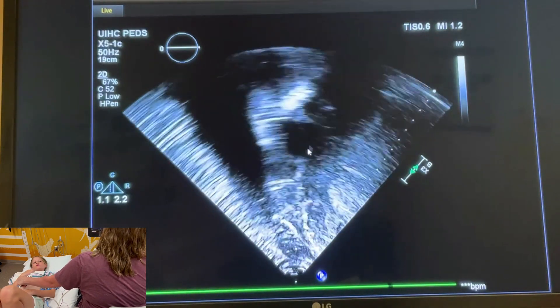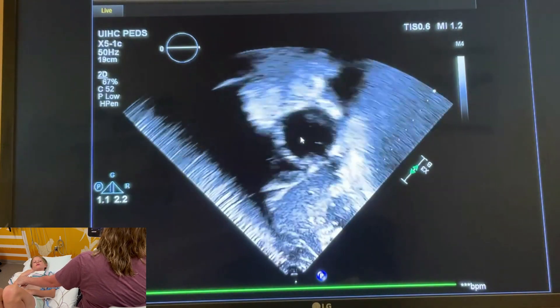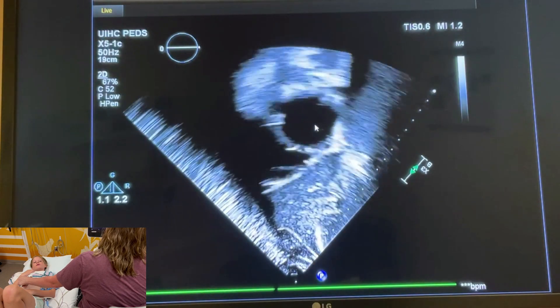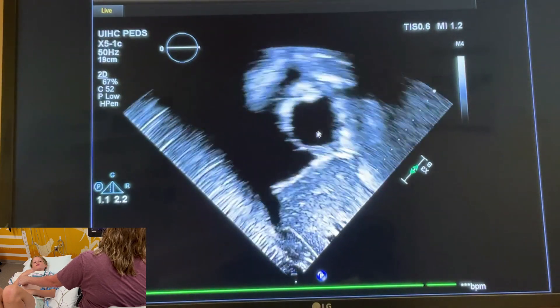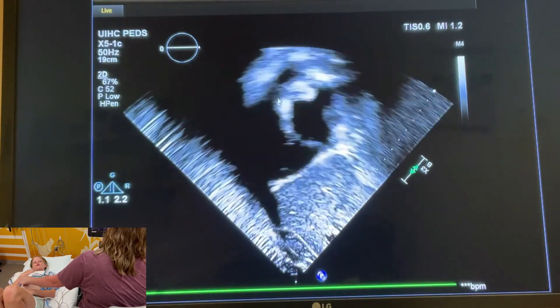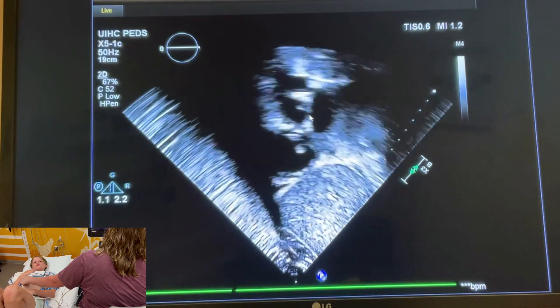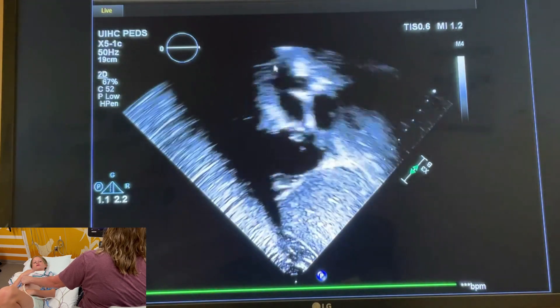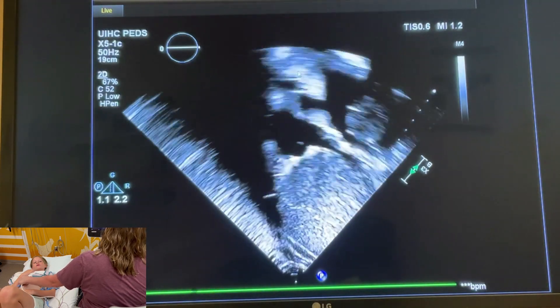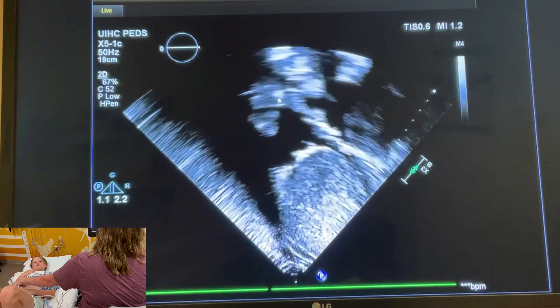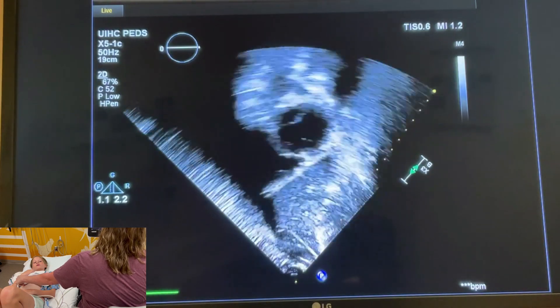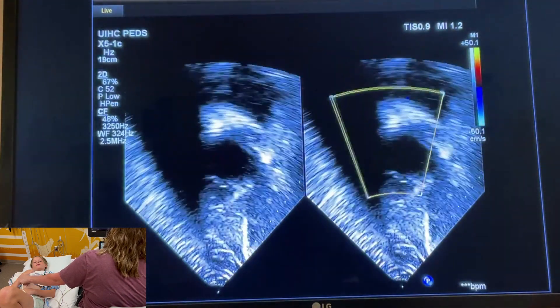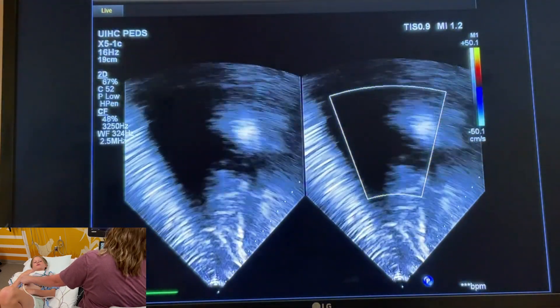Left ventricle — in the short view — mitral valve, right outflow tract, here's the aorta coming out, and then bicaval view. You'll do that with color and you're looking for any VSDs or any other shunting lesions.